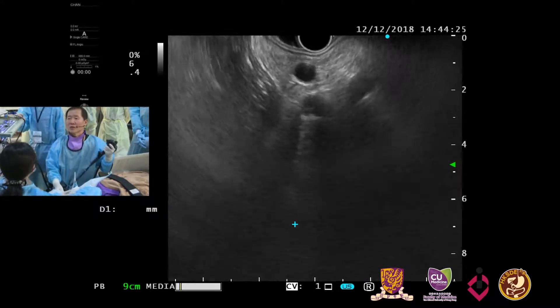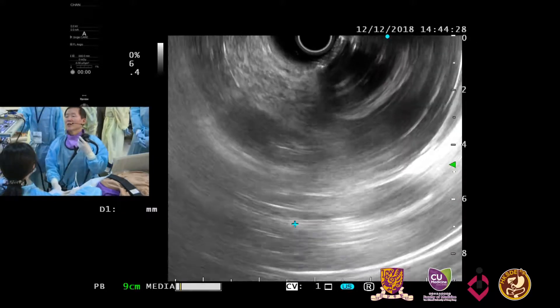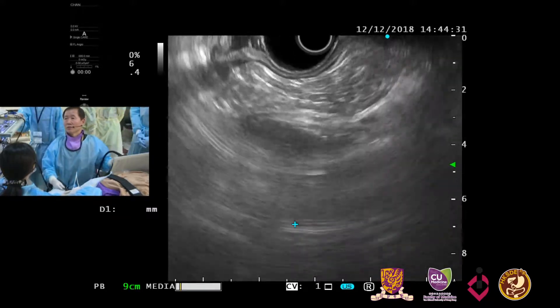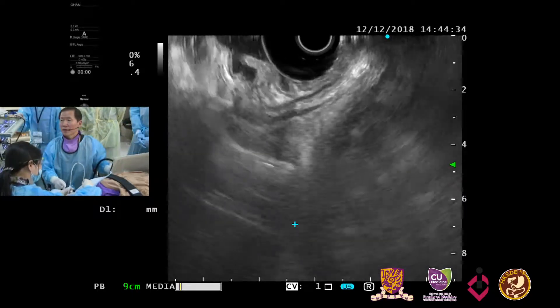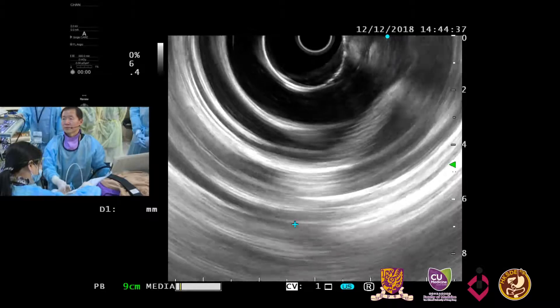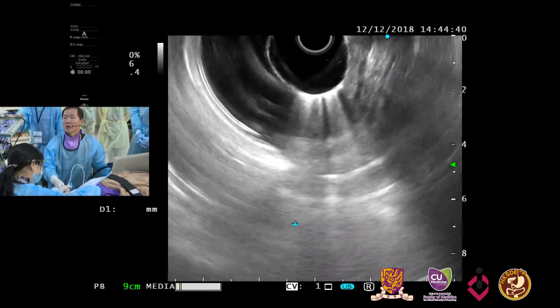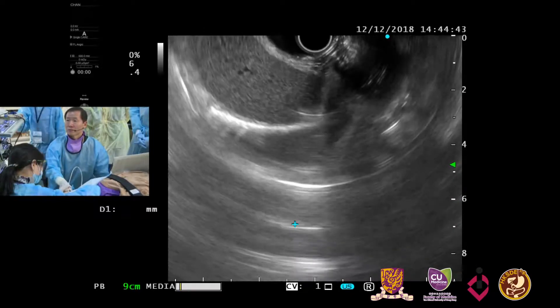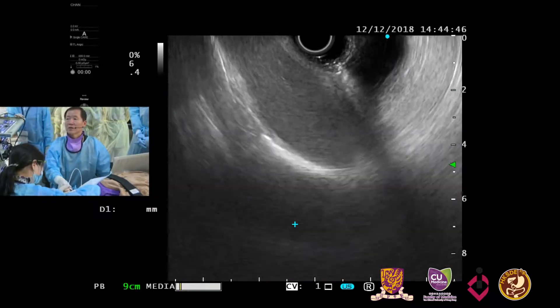This is the left kidney and the pancreas tail. This is the diaphragm in the proximal stomach right now. There is a lot of air here, but we can appreciate some part of the liver here.